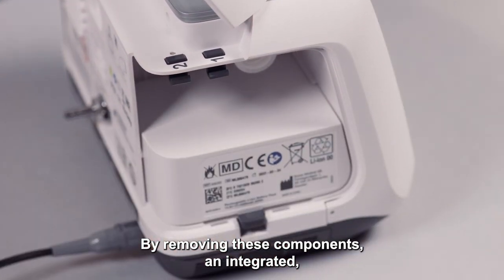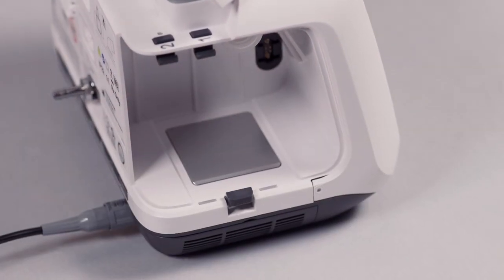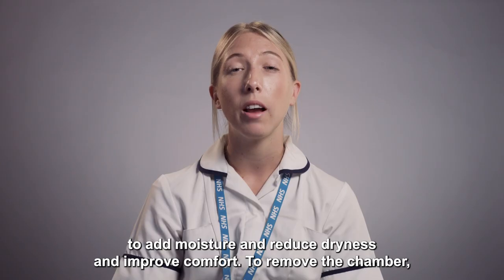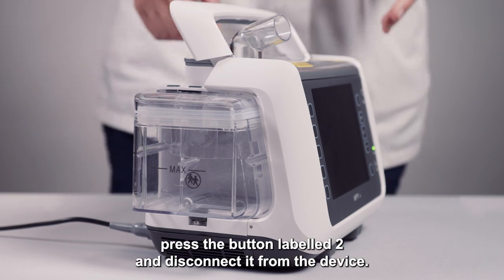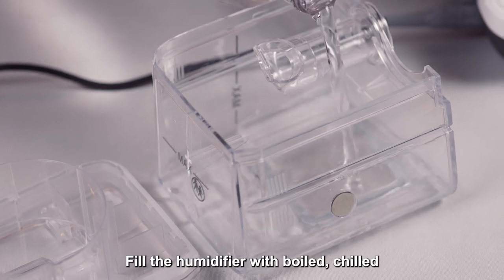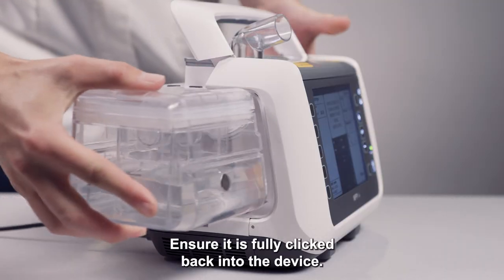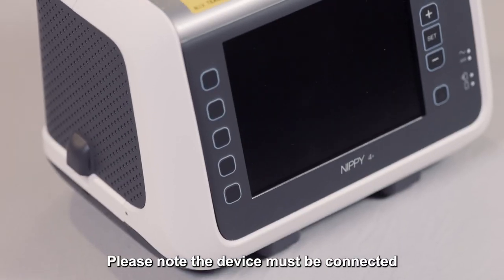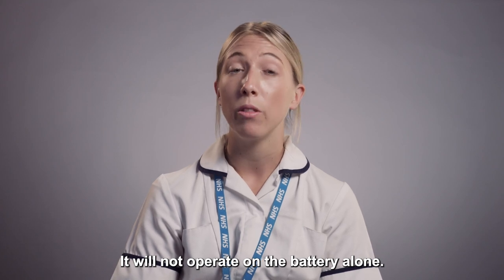By removing these components, an integrated heated humidifier chamber can be added. This enables air to be passed through a warmed water chamber, helping to add moisture and reduce dryness and improve comfort. To remove the chamber, press the button labeled 2 and disconnect it from the device. Fill the humidifier with boiled chilled tap water to the line marked on the side. Ensure it is fully clicked back into the device. Please note the device must be connected to AC mains to run the humidifier; it will not operate on the battery alone.